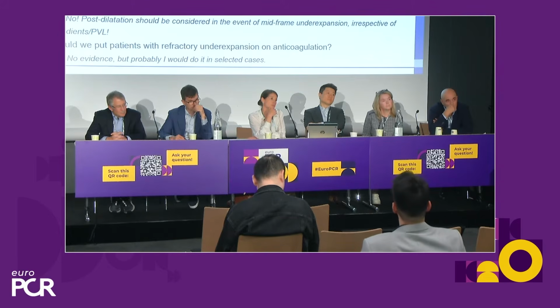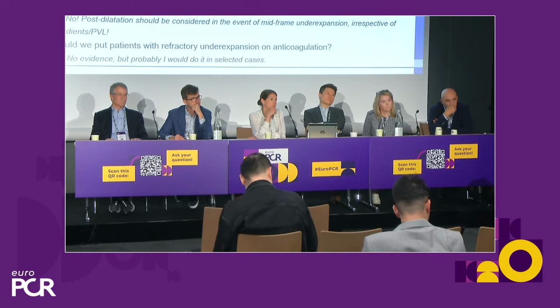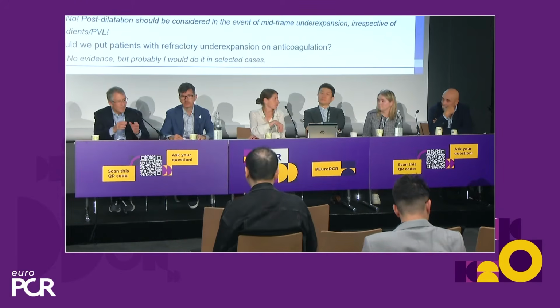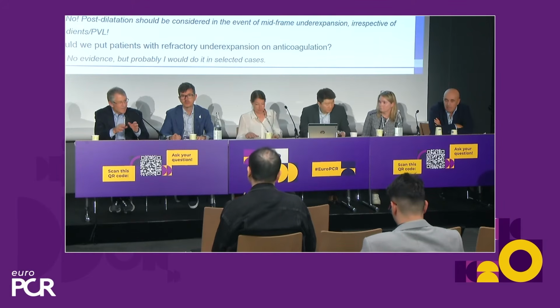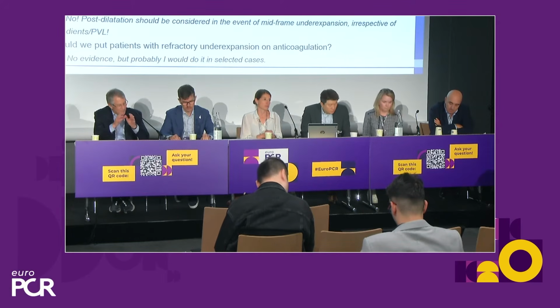And second, I think we should expand the indication for post-dilatation to not just PVL and hemodynamics, but also mid-frame under-expansion, which is probably a particular problem because of the top-down implantation mechanism of the Accurate valve. Yeah. So when we presented the IDE, that's one of the things we pointed out: we've typically post-ballooned for PVL or gradient, and that is not a guarantee that you're not under-expanded. So we presented this, and we eventually do not stop at that. Look at the frame and make a decision.